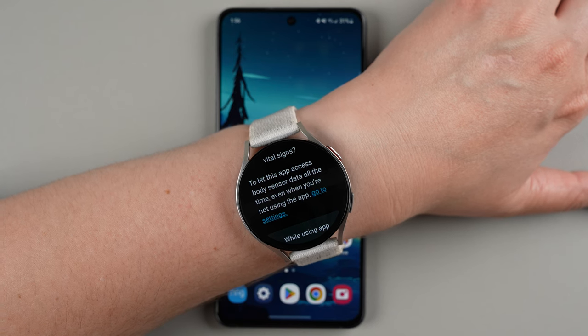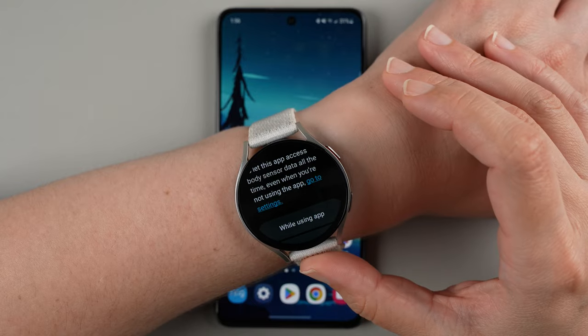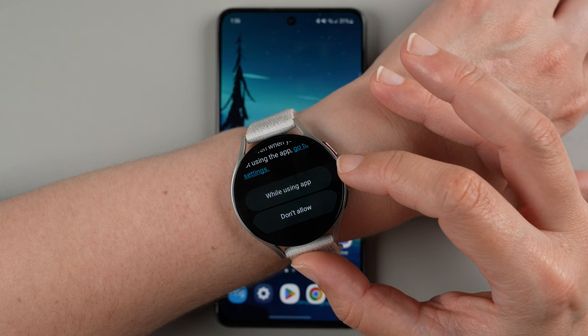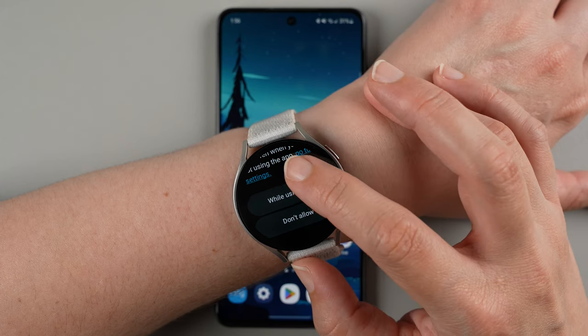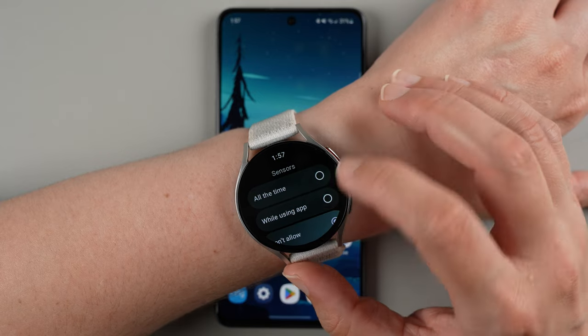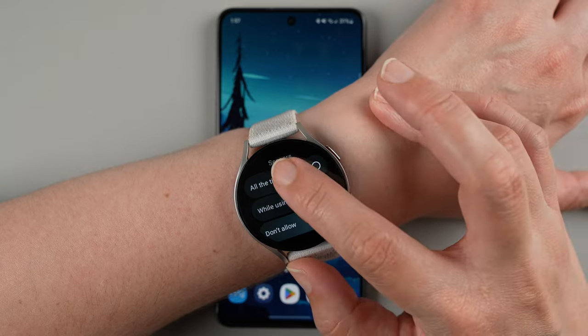I would probably recommend going ahead and allowing this all of the time. You can tap go to settings here, or you can tap just while using the app. I'll say go to settings and tap all the time. So we have don't allow, while using the app, or all the time — I'll tap all the time.